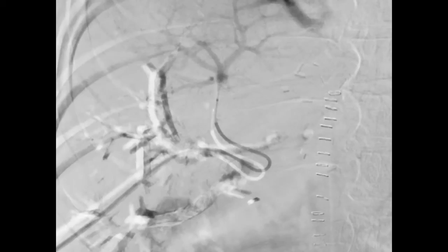Here is the portography after third branch occlusion. I move to the fourth branch without a need for reloading the wire. At that stage, another big advantage of direction: it is still working after the first 3 injections of Glubran. It is not stuck and I can complete the embolization.